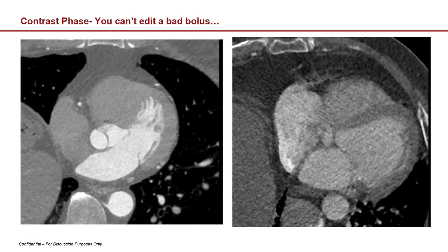Before we start talking about editing, I want to talk about contrast phase. You can't edit a bad bolus. I've got an example of a bolus that's correct where all the contrast has been injected and it's on the left-hand side — going through the aorta and out into the coronary arteries and the descending aorta. There's no contrast in the pulmonary arteries, just in the pulmonary veins.